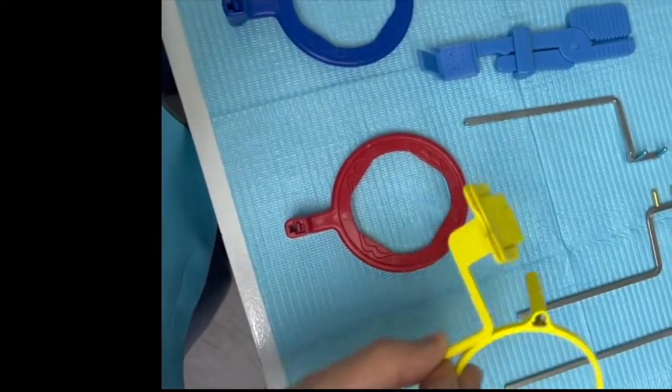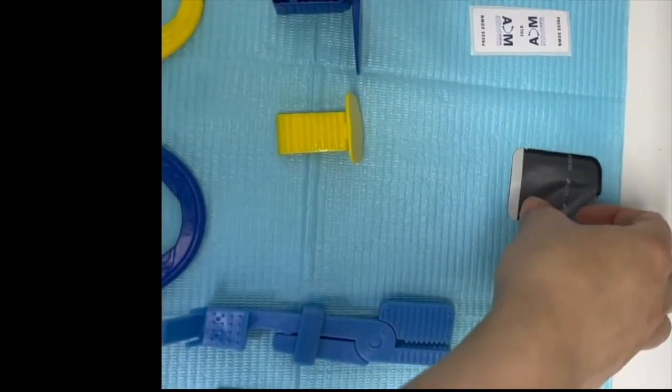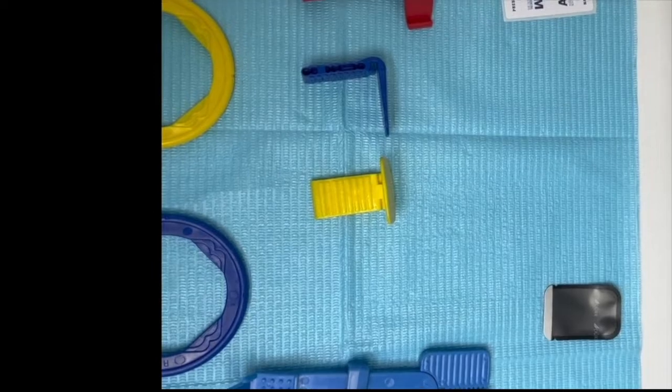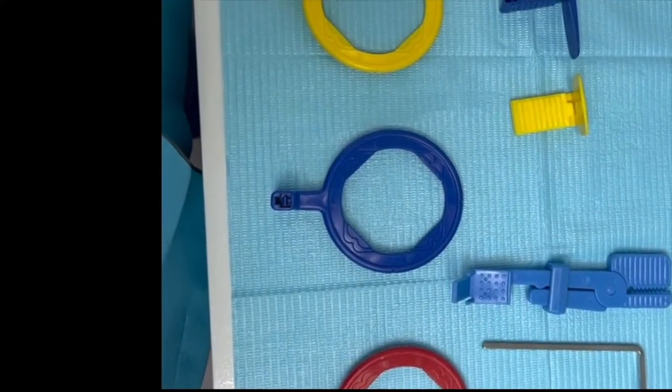I'm going to grab the yellow curve with the ring, put them in a container or on my hand, along with a size 2 film and the hygienic bag. I might also grab some bite tabs — not necessarily to stick to the film, but to stabilize the film if it's wobbly inside the film holder. With the curve system this generally doesn't happen, which is another reason I prefer it. With the ring system the film is less stable, so you may need the bite tabs.